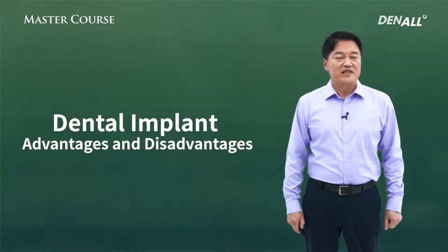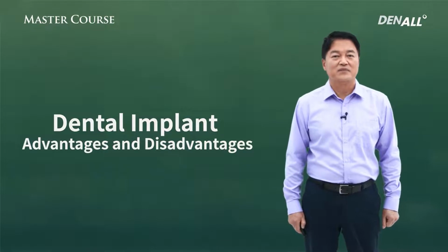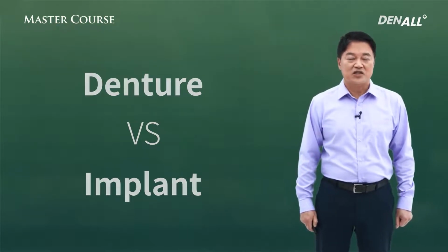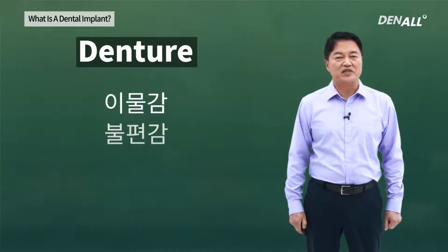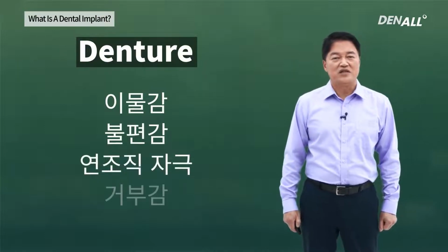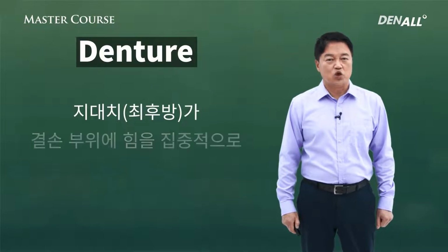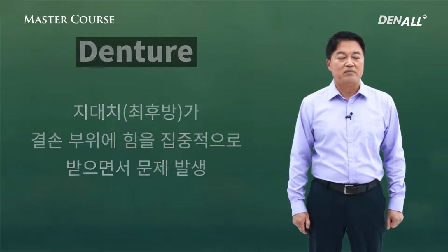Let's look at the pros and cons of implant treatment in detail. First, compared with denture, what advantages do implants have? As you know, with denture, there's irritation, discomfort is very significant, and it stimulates the soft tissue, and people have resistance towards denture. Another problem is that the most distal abutment receives most of the load from the missing area, and it can lead to problems.